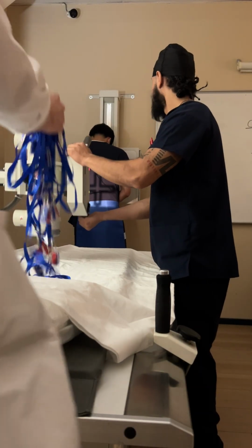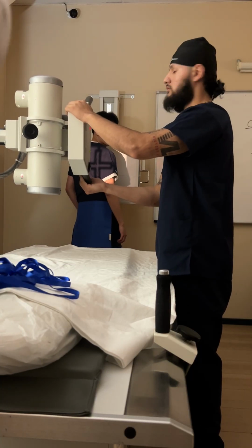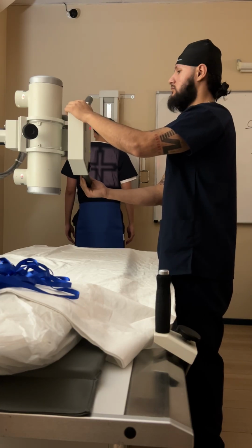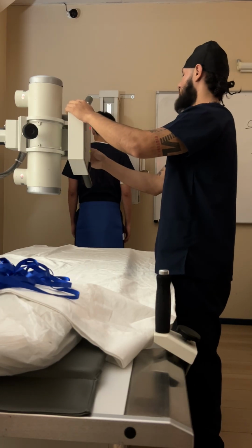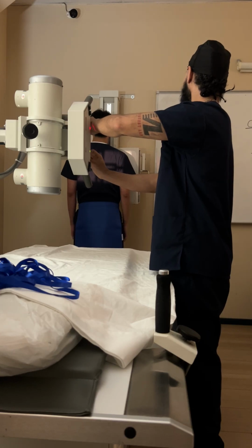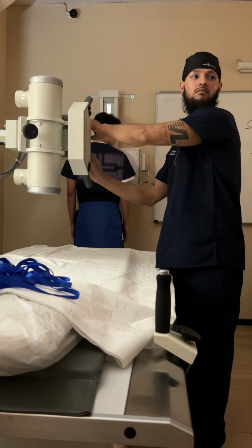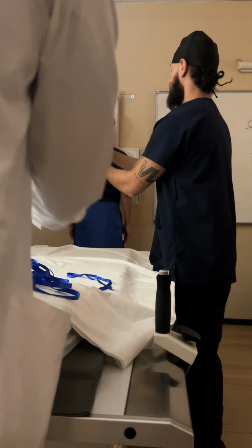Easiest thing for a chest X-ray series, though, is to just use the left for the whole time. Then you don't have to switch markers or worry about putting the right marker. Techs always lose their left marker because they're always using their left. True. Your right marker will always be on your badge, but left will always be on a patient. And that's because it's used more, because of the magnification of the... Or is it just because it's used?